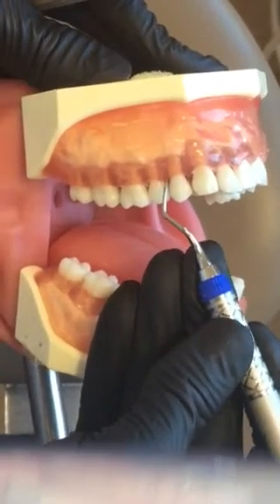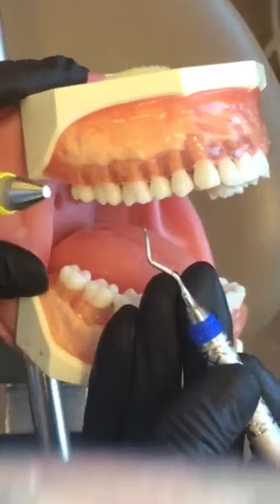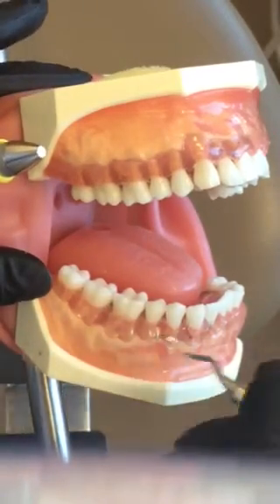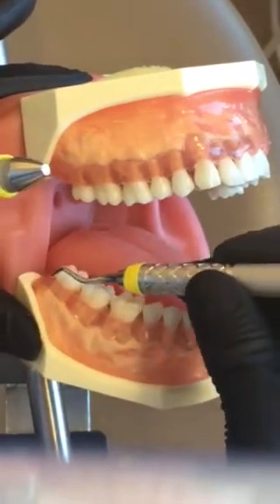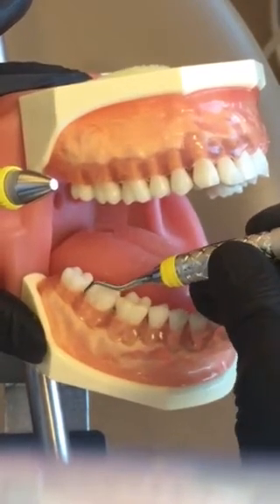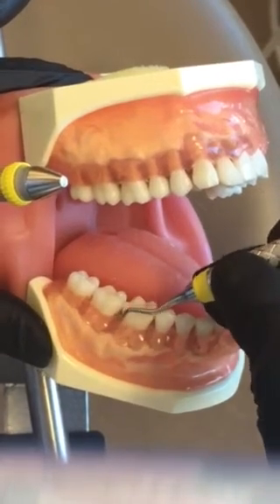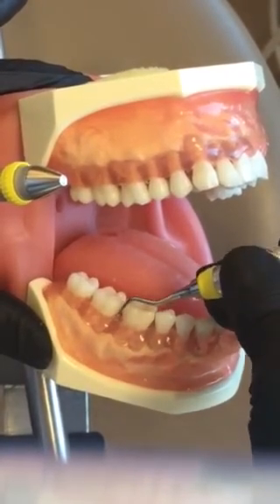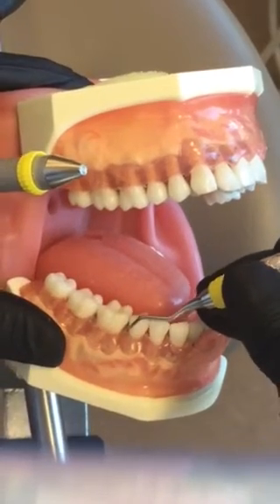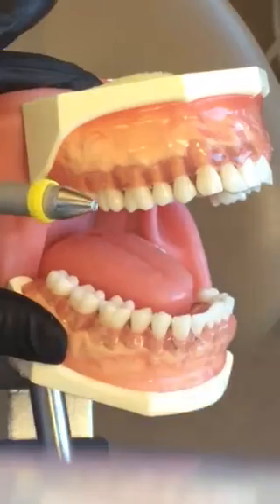This is your Gracie 13/14. It is distals only on the posterior teeth — distal only. This is great for deep pockets to remove light to moderate subgingival calculus.